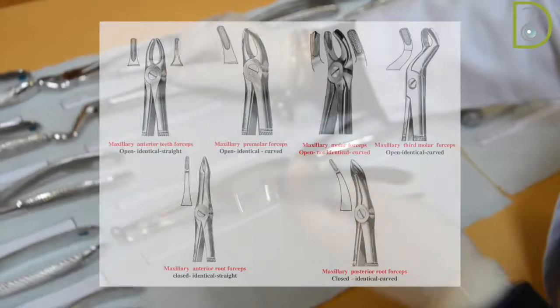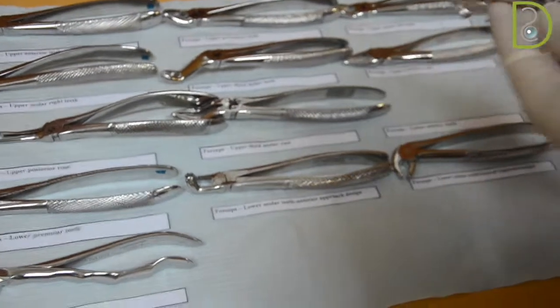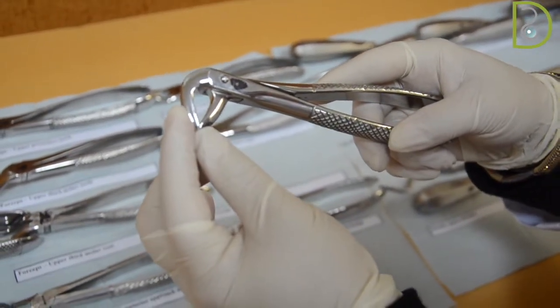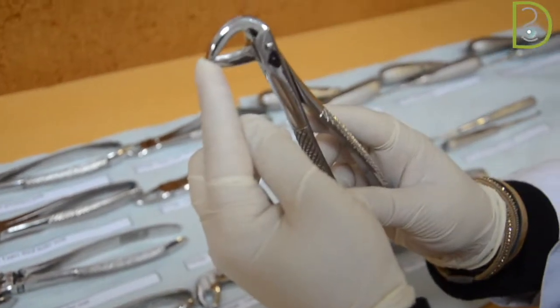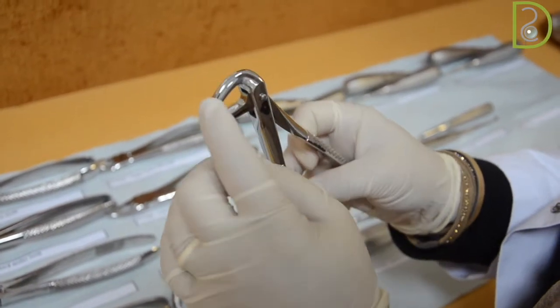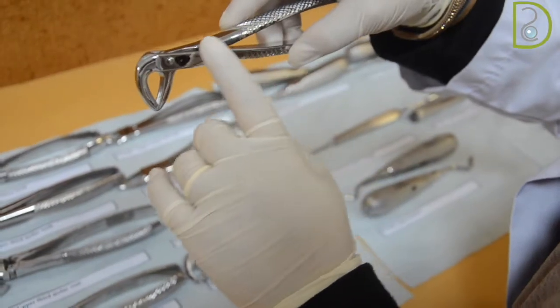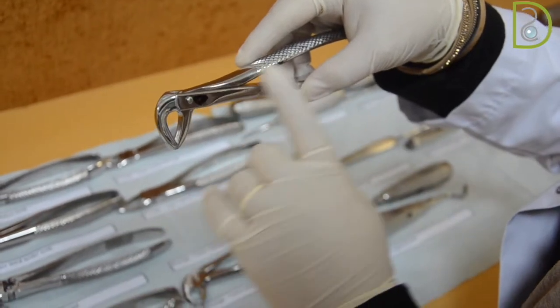Now we will start talking about the lower teeth forceps. If you remember the shape of the lower anterior teeth, you would know that they are buccolingually very narrow compared to the upper anterior teeth. Thus, you don't need open beaks here. You will only need a little bit of broadness in the beaks, and they have to be closed so you can catch them. Also, you will find that the beaks are at a perpendicular, or 90 degree, angle with the handles.